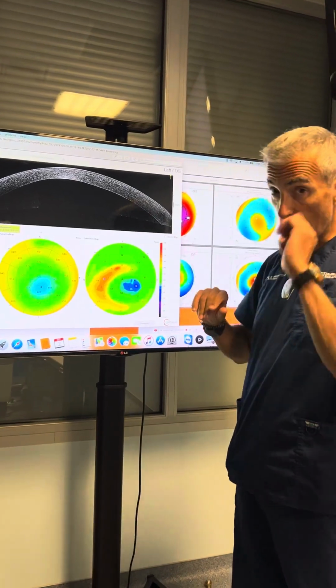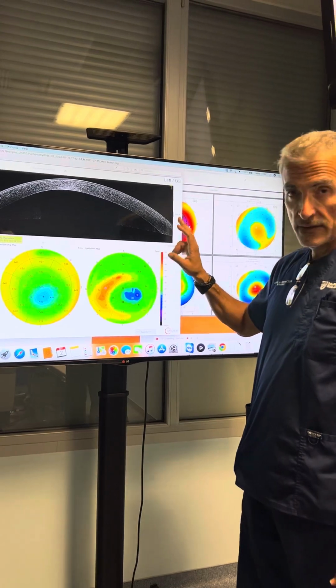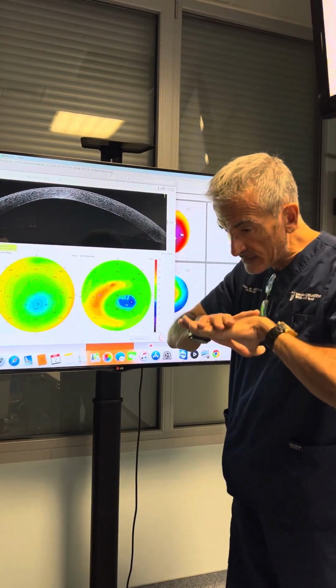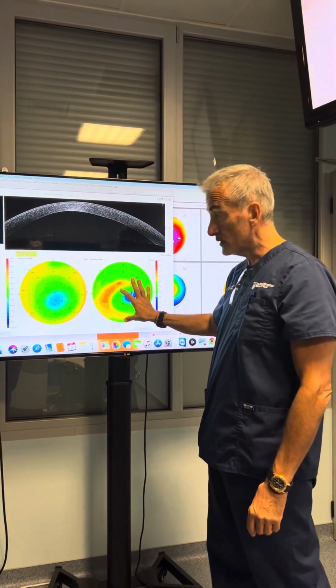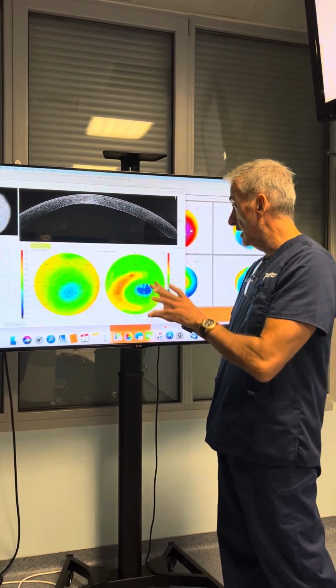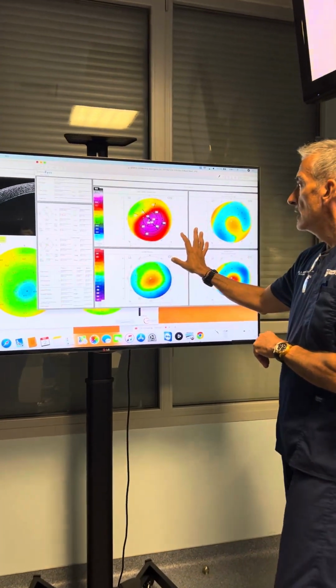The patient either rubs his eye, it's the left eye that's worse than the right eye, or, and this is the more common reason for this, sleeps on his left eye, sleeps face down on his hands, and probably rubs his eye to find comfort from the allergic foundation that is evident with keratoconus. So we have an over 50 gentleman with active keratoconus. Let's go and look at the Pentacam maps.